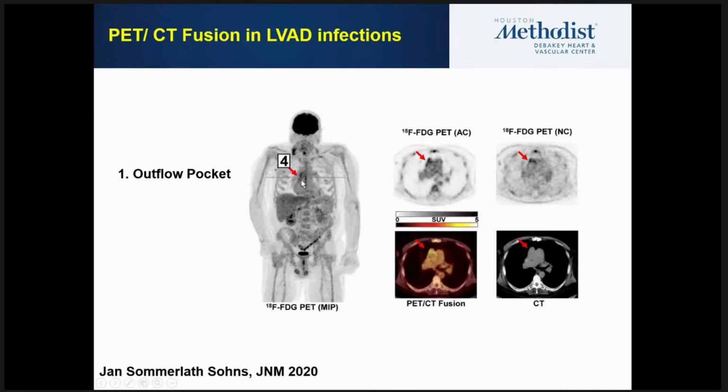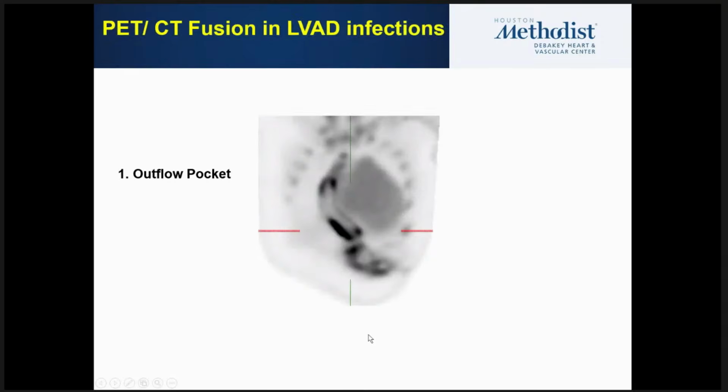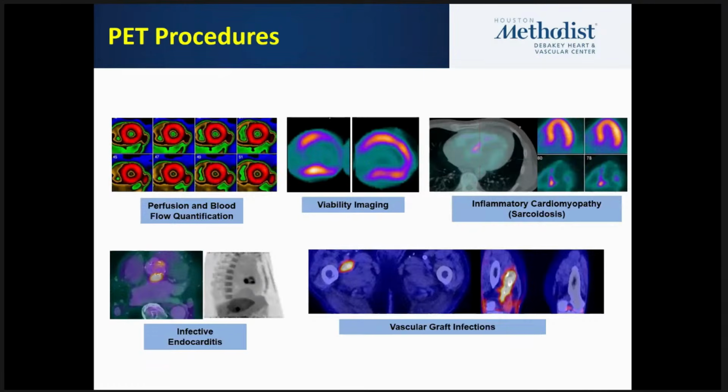And this is a patient, for example, who had an infection in the outflow cannula from the literature, but this is another patient from our lab, and you can clearly see the outflow cannula has very intense FDG uptake, and there is significant inflammation due to infection in this patient.